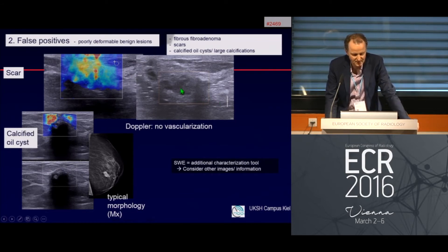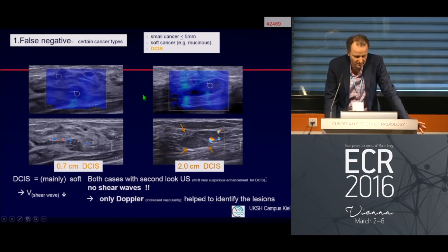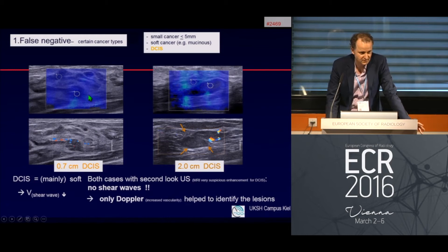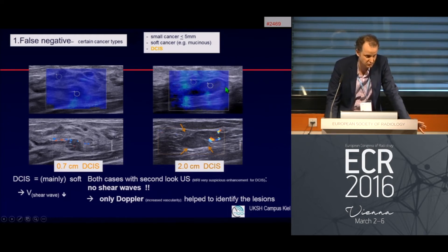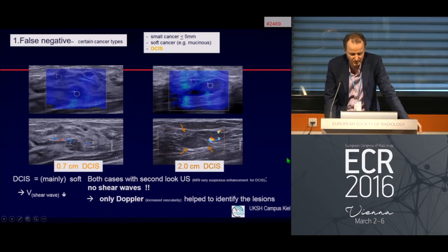False negative cases include very small cancers — two, three, or four millimeters — as well as very soft cancers like mucinous cancer, and also DCIS. An example of DCIS with hypervascularization that is suspicious can appear overall blue — a false negative. A two-centimeter DCIS very suspicious on MRI can also show almost homogeneous blue with vertical cords, a pattern 2 finding. No technology offers 100% sensitivity and specificity, so false negatives do occur.